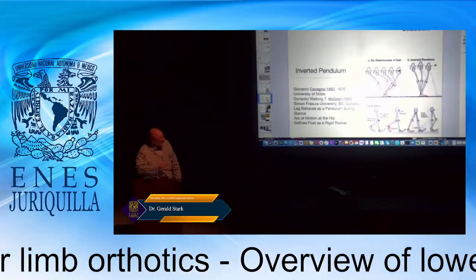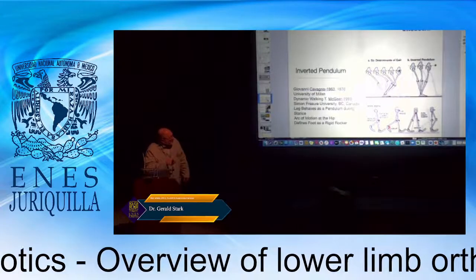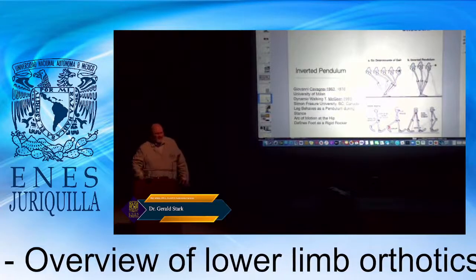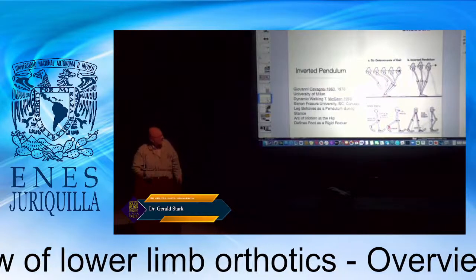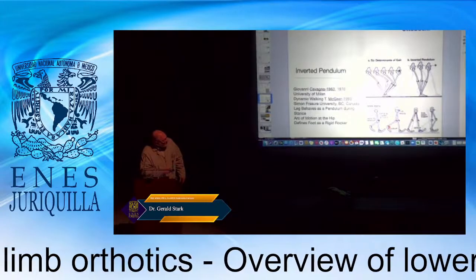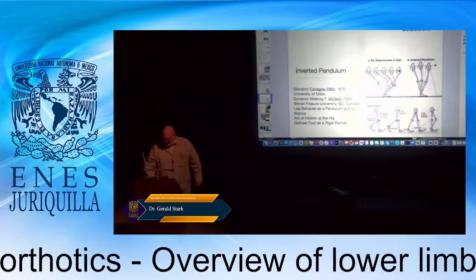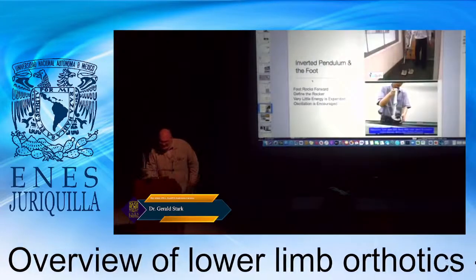So the knee flexion at heel strike is what's eliminating this. The inverted pendulum, however, says that oscillation should not only not be minimized, it may be necessary for walking, and says that the leg is attached to the floor and arcing. So these things are important to you in orthotic design as well.